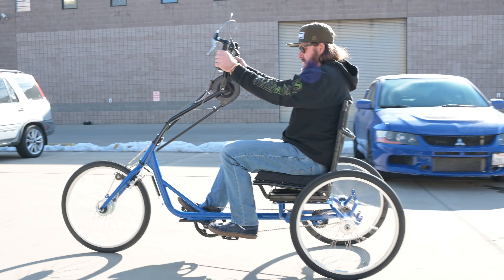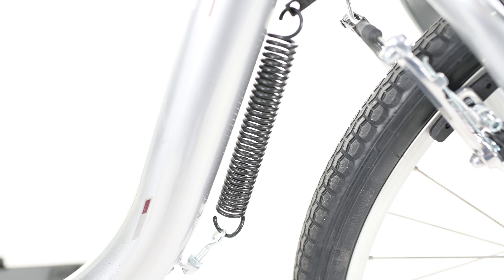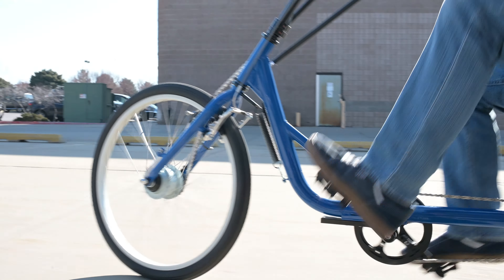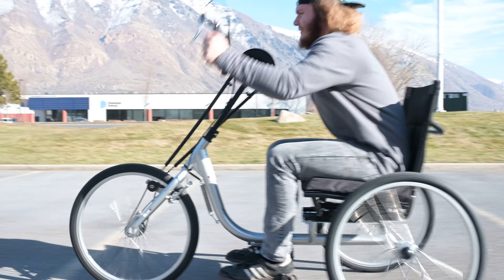You can also brake by rotating the cranks backward. There's also a spring attached from the frame of the trike to the fork to keep the front wheel from wobbling as you turn the hand cranks. The spring also helps to make the turns smoother while you ride.